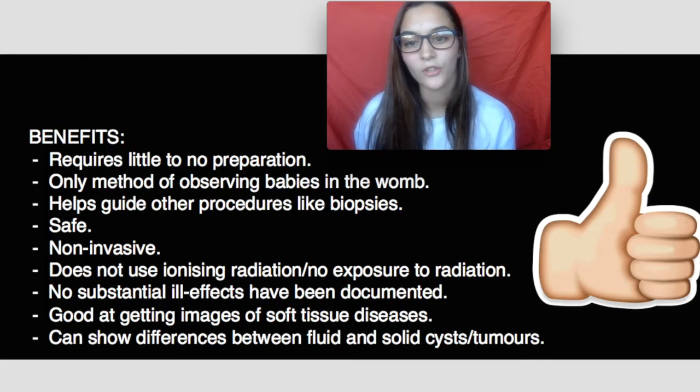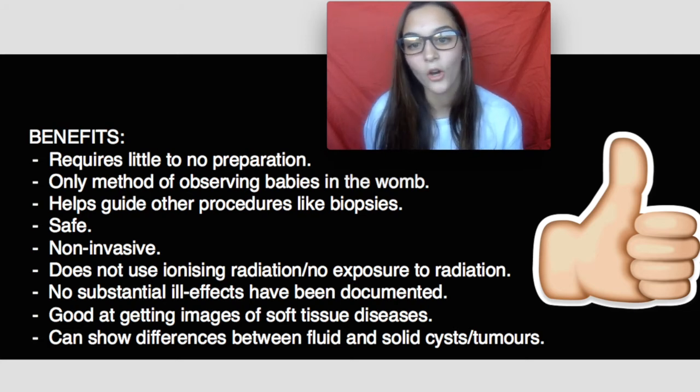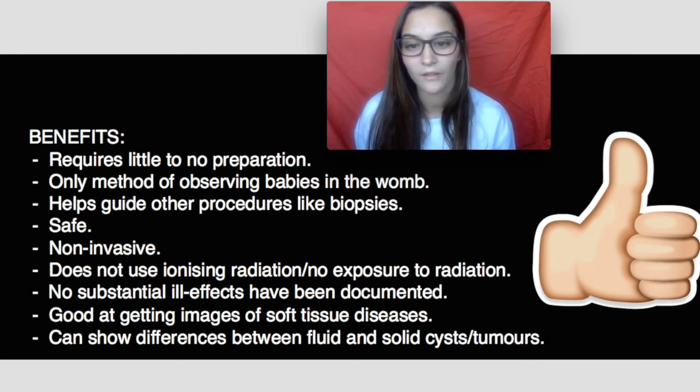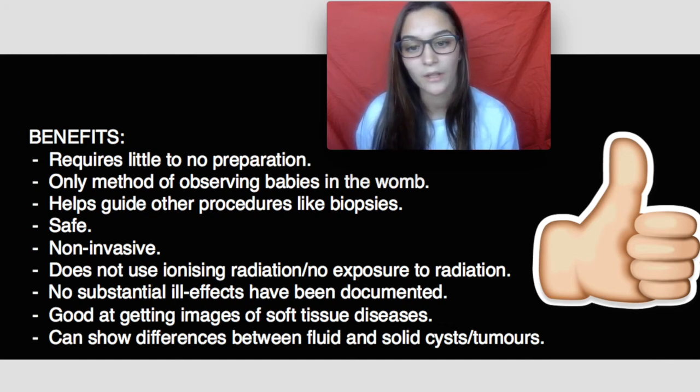The benefits of an ultrasound include that it requires little to no preparation. It's the only method of observing babies in the womb. It helps guide other procedures like biopsies. It is safe and non-invasive, and it does not use ionizing radiation, nor does it expose the patient to radiation. There are no substantial ill effects that have ever been documented, and it is really good at getting images of soft tissue diseases. And it can show the difference between fluid and solid cysts and tumours.